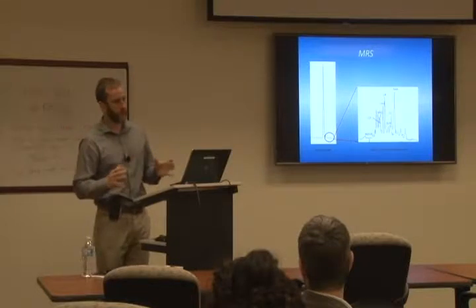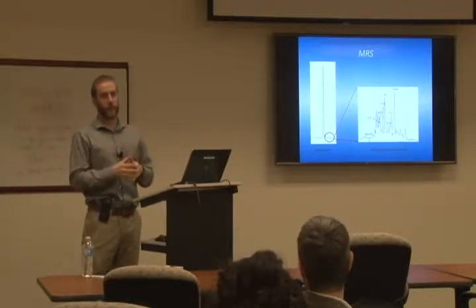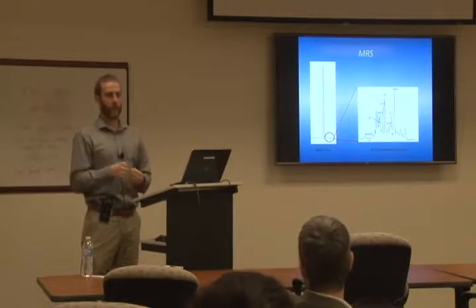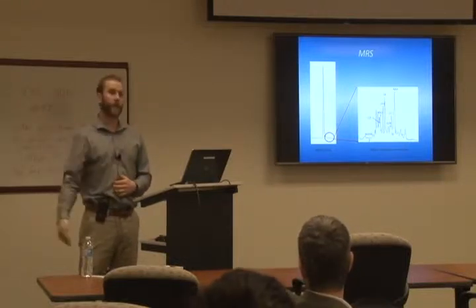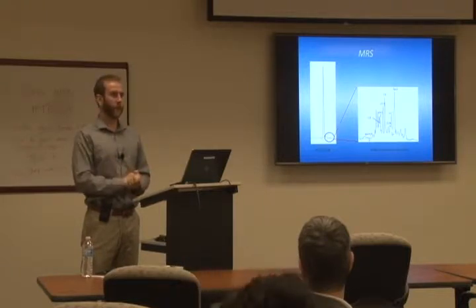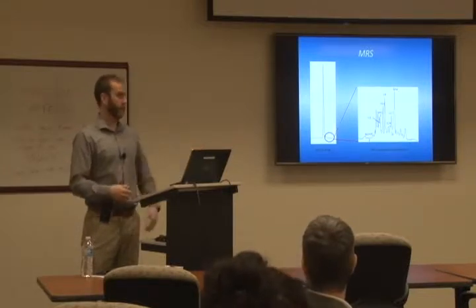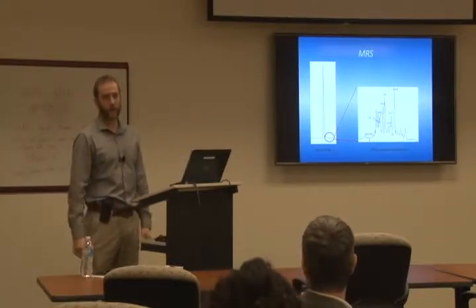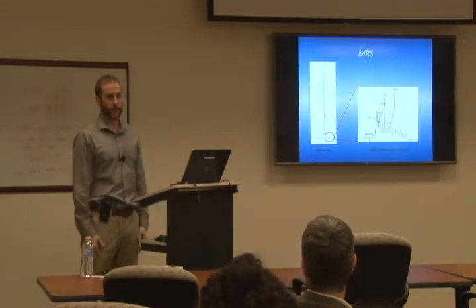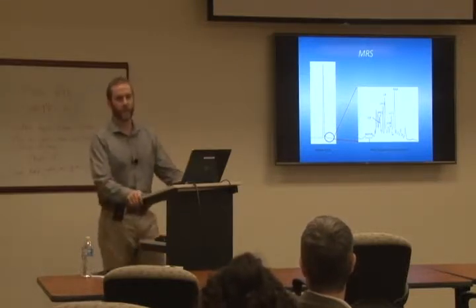The thing about Siemens, when you're programming with Siemens, is that everything has to be perfect. Your timing has to be perfect, your estimation of the SAR values has to be perfect. All that has to be perfect. Otherwise, it'll give you errors in a compile. Unlike other environments, like when I was using Varian, I could just throw an RF pulse in there, and it may be giving me the wrong data, but it's not telling me, right?